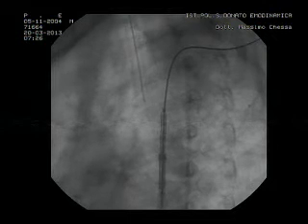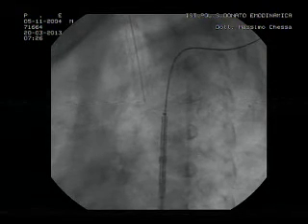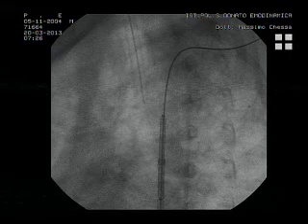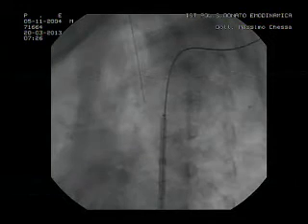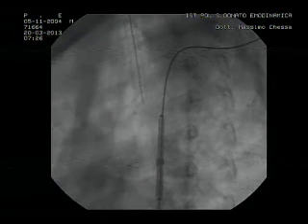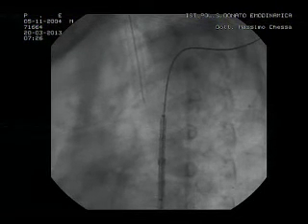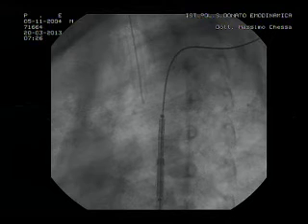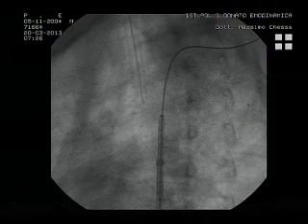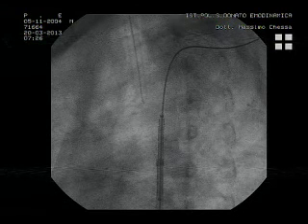So, Massimo, you and Elkanen agreed on the 41 millimeter. What would be the next shortest stent for the Advanta 12? The shortest is 29, I think. As Carlos Pedro knows, I always think sometimes they look way too long for the lesion. Two thirds of it are below the lesion, which is not necessary. So I guess it's just the disadvantage of the discrepancies in the lengths available. Yes, actually, once dilated, the stent will be around 35.